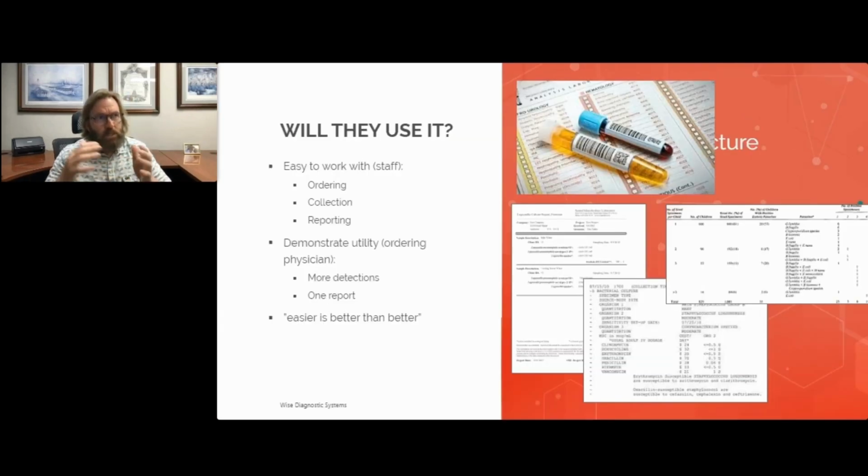And so because it's primarily the staff, not necessarily the physician, it's to make ordering simple. How do we make it? For us, we use one tube, we use one swab. It does not have to be refrigerated. We make the requisition largely stickers and staples, right? They can check boxes, they can add a patient information sticker on there, they can staple demographic information to it as well. Make the collection easy for the patient or the staff if they have to swab.